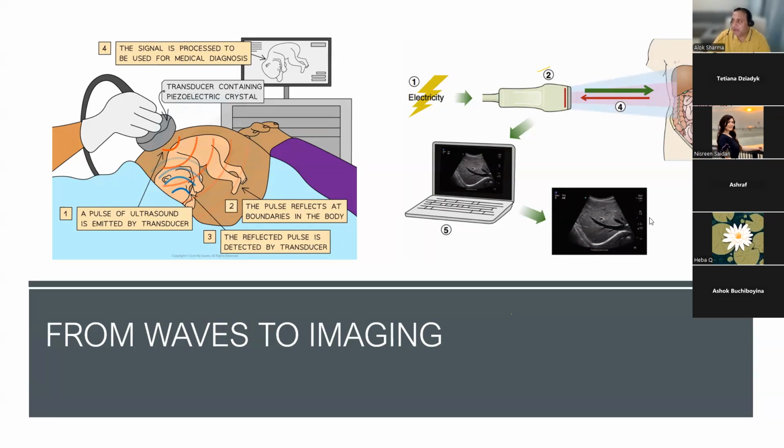A simple example is if you've got fluid, as you can see in the portal sinus over here, it's got a lower density. Because it's got a lower density, sound waves tend not to reflect back. They will pass through without reflection, and if they're not coming back to the probe with a lot of reflection, you're going to get a very anechoic image, a dark image that you can see over here. But if they interact with tissue which is very cellular, really what you're going to have is the tissue capsule, which is very dense tissue. So a lot of reflection from the liver capsule, giving it a very bright image, and then a lot of interaction and trapping within the liver tissue, which then gives you the liver architecture.